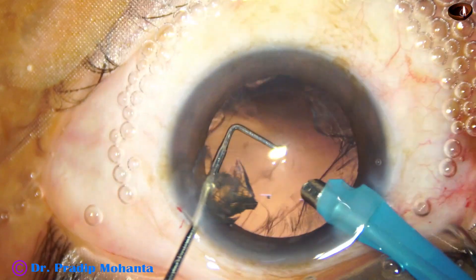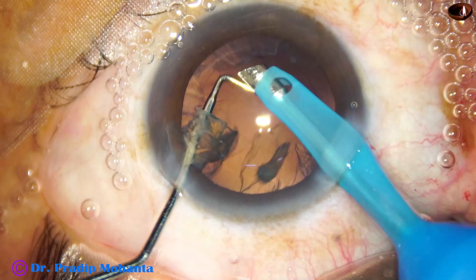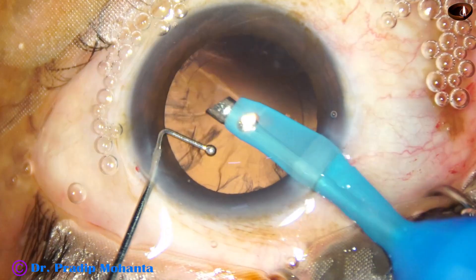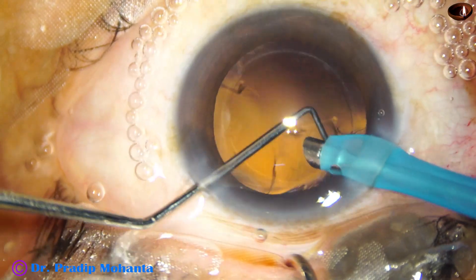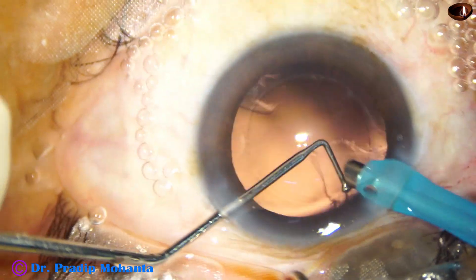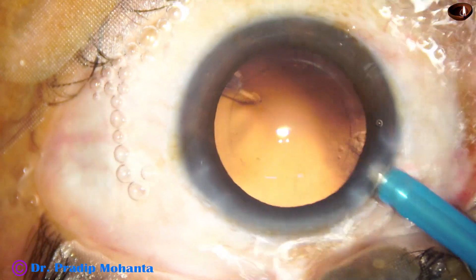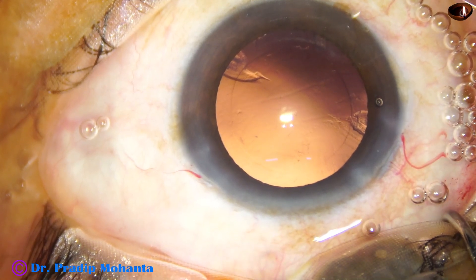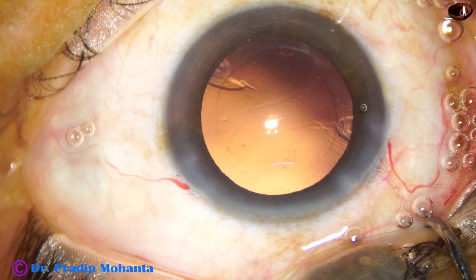This Neto chopper is a long instrument and new surgeons will feel it is cumbersome — I was thinking the same — but if we use it, this is the advantage: we can protect the posterior capsule by the ball and we can keep the posterior capsule away from the aspirating port of the phaco tip, the phaco needle.